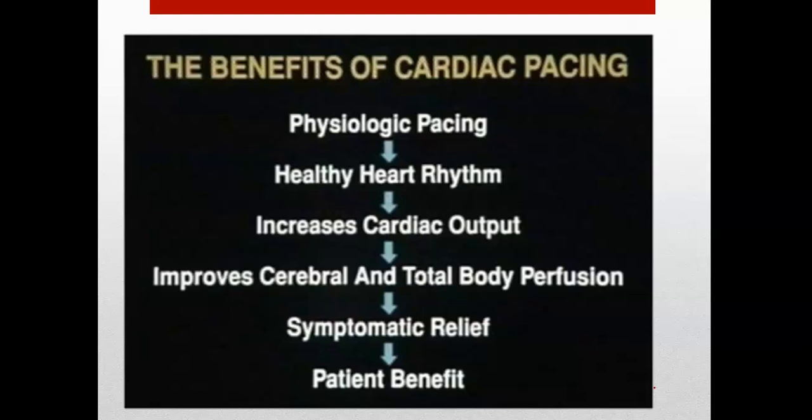But if we use pacing unnecessarily, it can also lead to worsened outcomes that include things like heart failure, new onset AFib, and it really just increases our mortality rate.